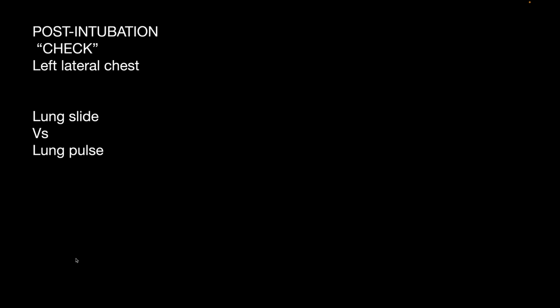Okay, now this is another short video which I find particularly useful as a post-intubation check. Traditionally we would listen to the chest and make sure there was air entry on both sides. However, we know that that's actually not particularly accurate, and in a very noisy resus that can be very tricky to do. So let's just play this video.